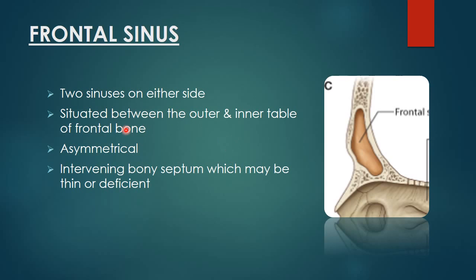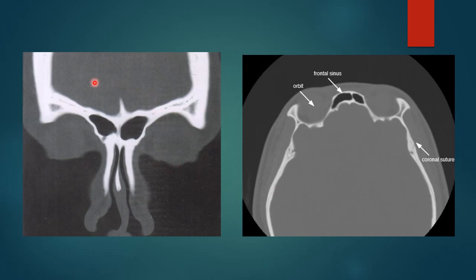Coming on to the frontal sinus: there are two sinuses on either side, situated between the outer and inner table of the frontal bone. This is the anterior table, this is the posterior table, and between them there is an air-containing cavity called the frontal sinus. They are usually asymmetrical, with an intervening bony septum between them that can be very thin or even deficient. The coronal CT image shows bilateral frontal sinuses with an intervening bony septum, and the axial CT image also shows bilateral frontal sinuses with the intervening septum.